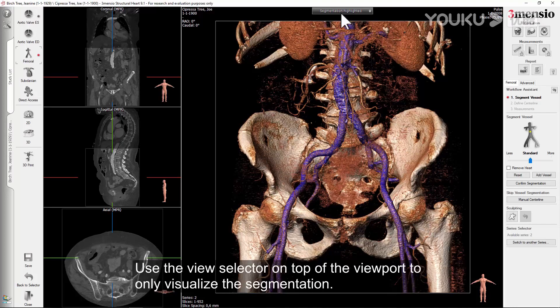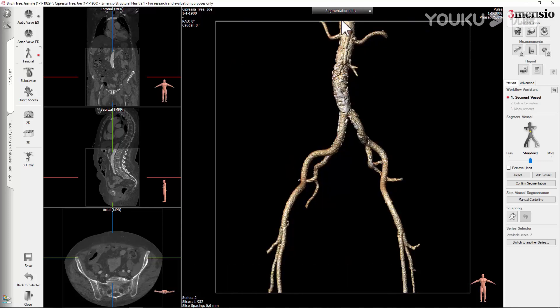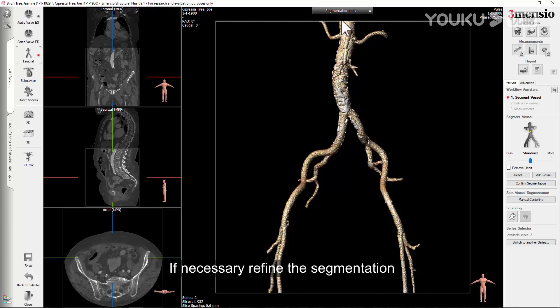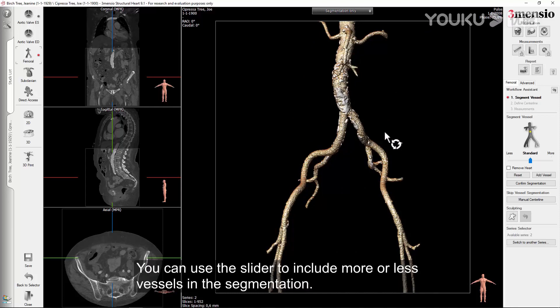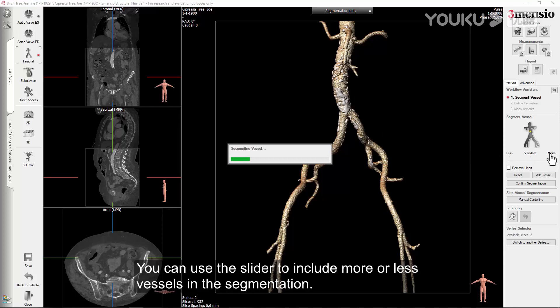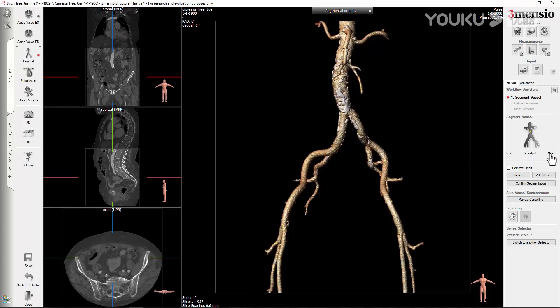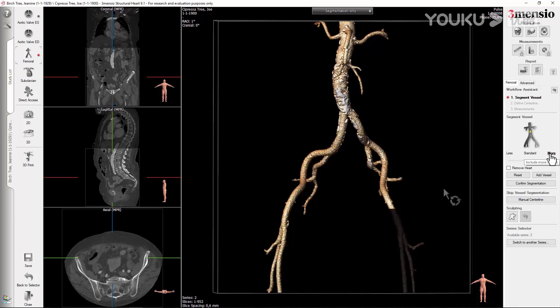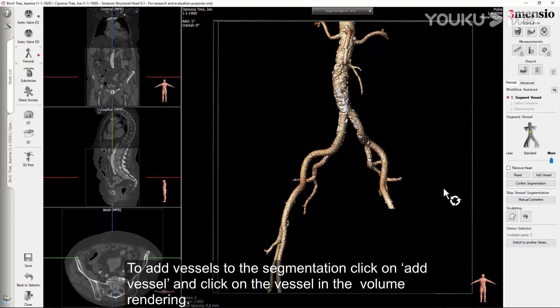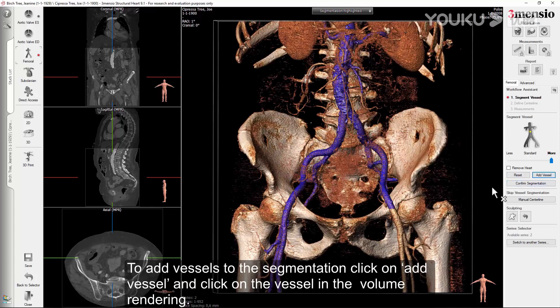Use the view selector on top of the viewport to only visualize the segmentation. If necessary, refine the segmentation. You can use the slider to include more or less vessels in the segmentation. To add vessels to the segmentation, click on Add Vessel and click on the vessel in the volume rendering.